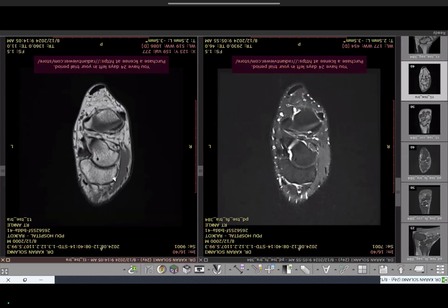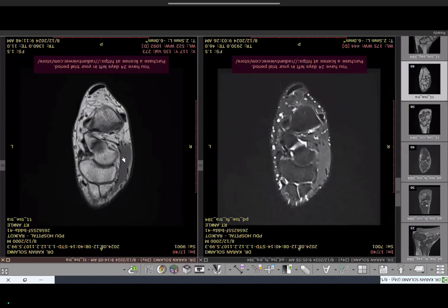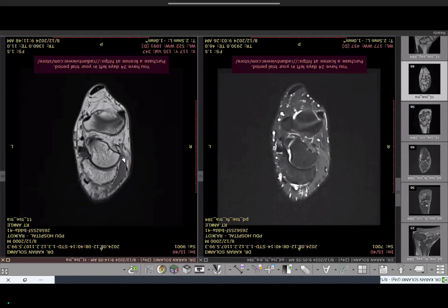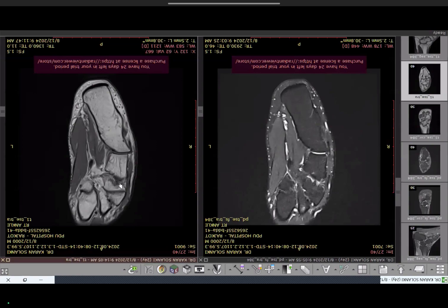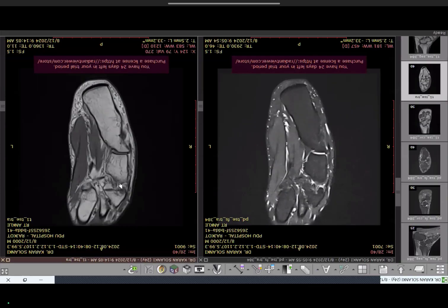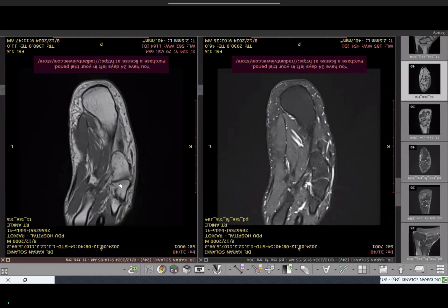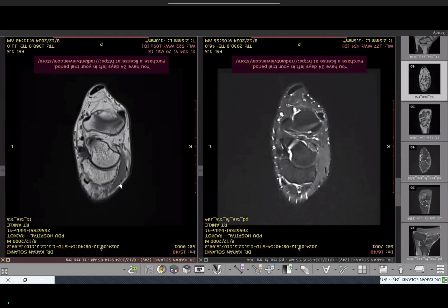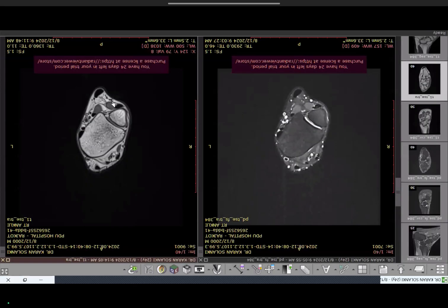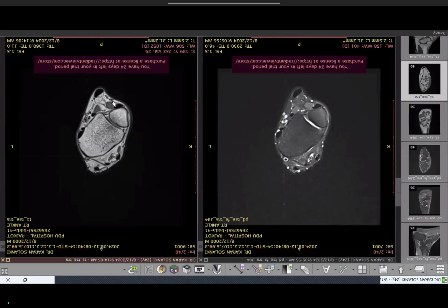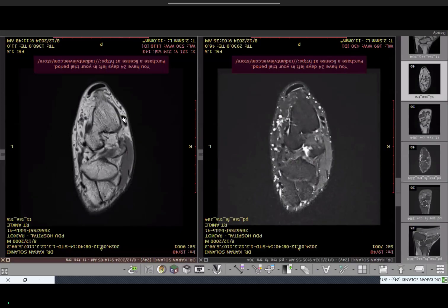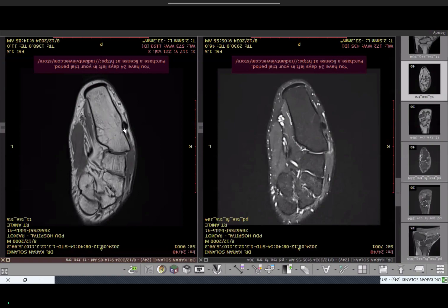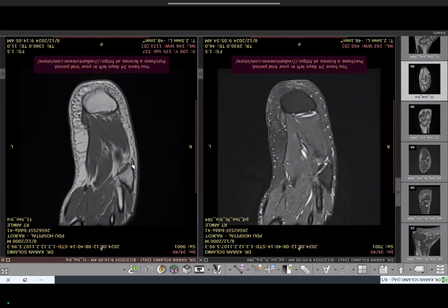Extensor digitorum brevis arises from and inserts within the foot; along with extensor digitorum longus it will insert at the distal phalanx of the second to fifth toes. In the posterolateral compartment we have peroneus longus and brevis. Tracking peroneus brevis down, it inserts at the base of the fifth metatarsal. Peroneus longus is traced further into the sole of the foot, passing through the tunnel of the cuboid, inserting at the base of the fifth metatarsal — actually the first metatarsal base.